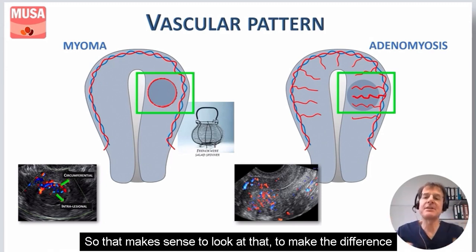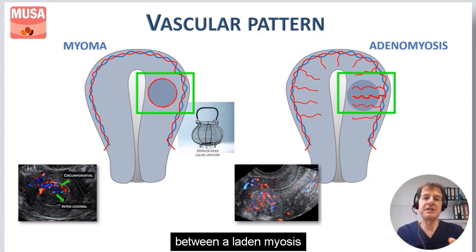So that makes sense to look at to make the difference between adenomyosis and the typical fibroids.